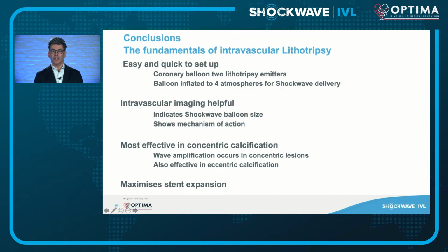So in conclusion, the fundamentals of intravascular lithotripsy. Well, firstly, it is easy and quick to set up. The coronary balloon has two lithotripsy emitters. The balloon is inflated to 4 atmospheres for shockwave delivery.